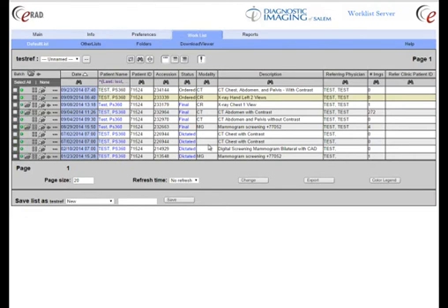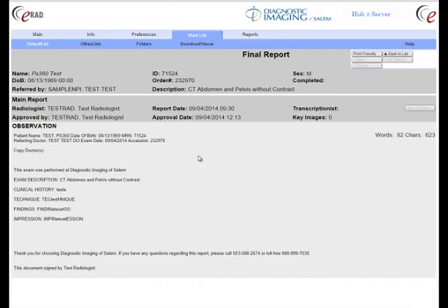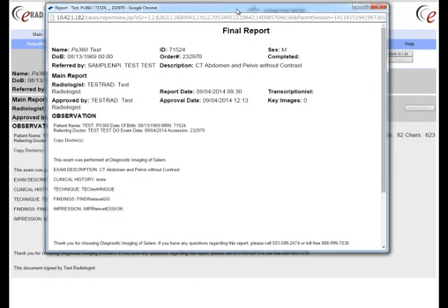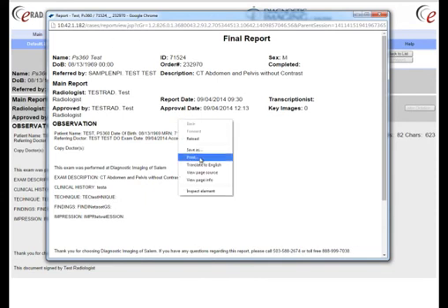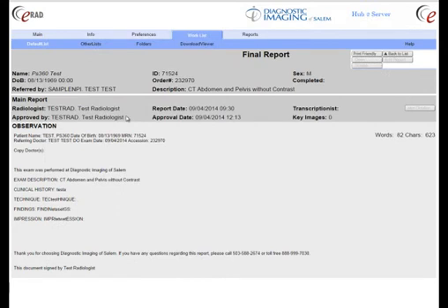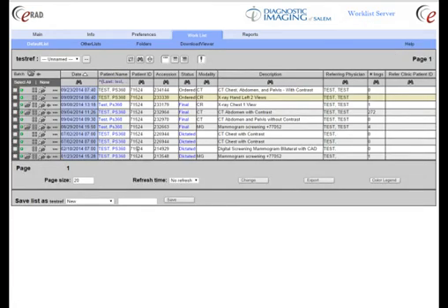So going back to the patient list — another way to view the report, and a better way for printing it, is by clicking on the 'Final' link on the main page. That brings you into a larger, easier-to-read view of the report. If you want to print it, hit the 'Printer Friendly' button, which brings up a printer-friendly web page — then right-click and hit print from there. Printing directly from the regular page would include logos, toolbars, and everything, so it doesn't make the best-looking report.